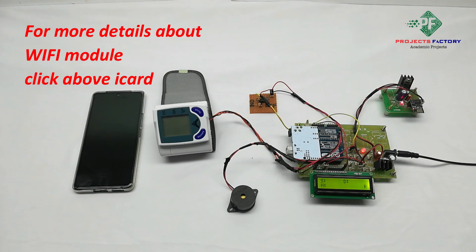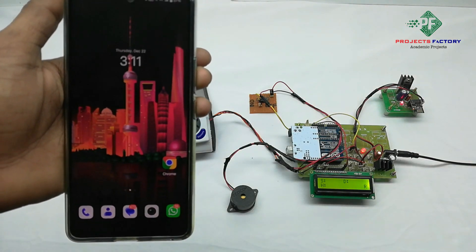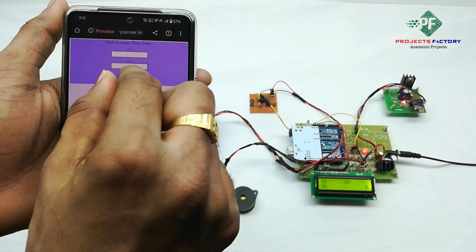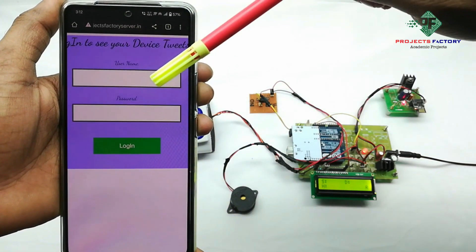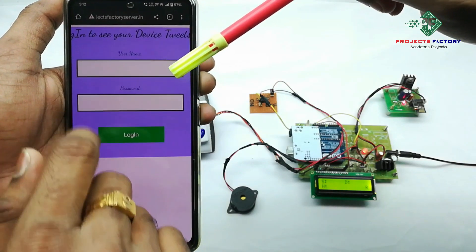We will see this data in the IoT server. Now we open the IoT server — you can see it is asking for a username and password. The username is 'IoT116' and the password is 'IoT116'.